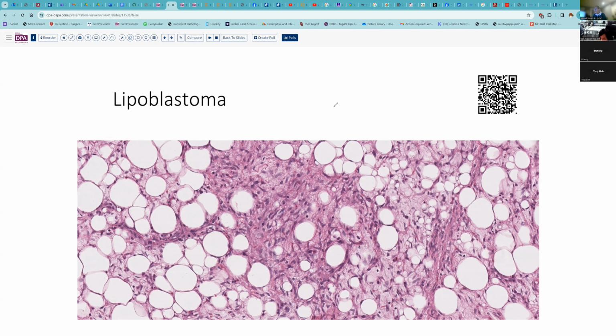Well, let's say they have a nucleus here that has indentations, because it has lipid droplets that are surrounding it and pushing in on the nucleus here.